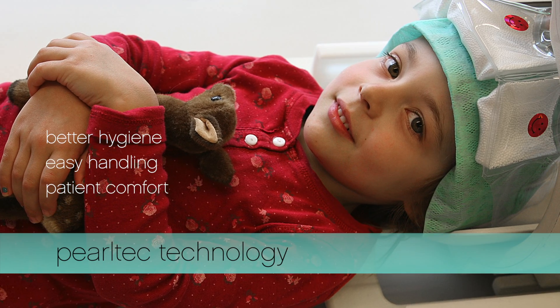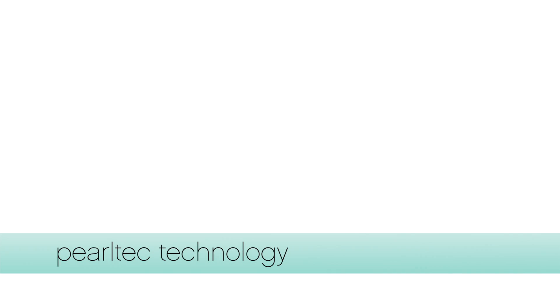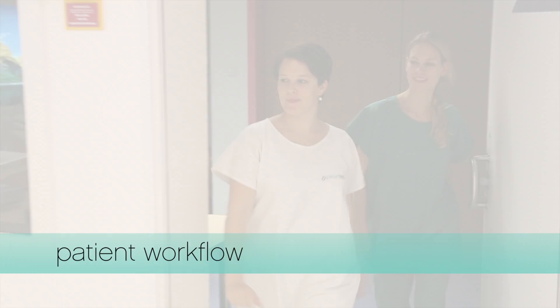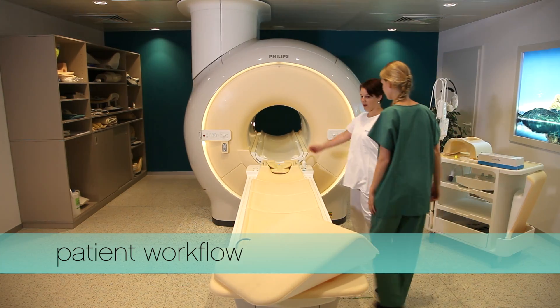The new PearlTech patient positioning devices enhance the workflow efficiency of your department. This video demonstrates how easy it is to use crania, PearlTech's head positioning device.